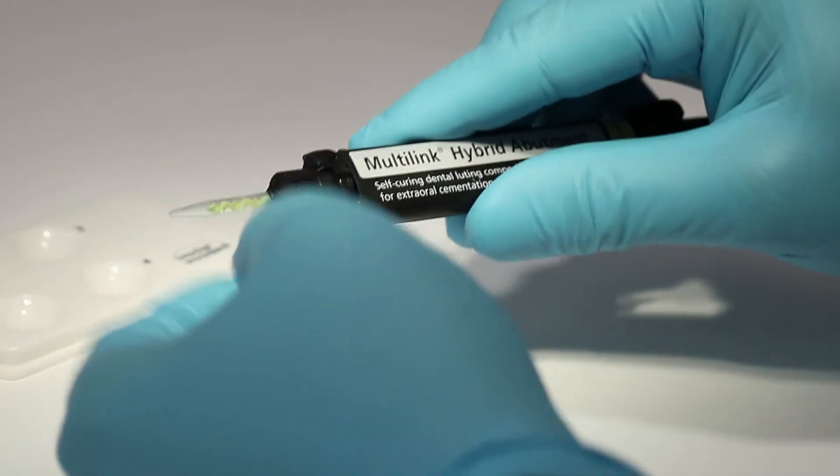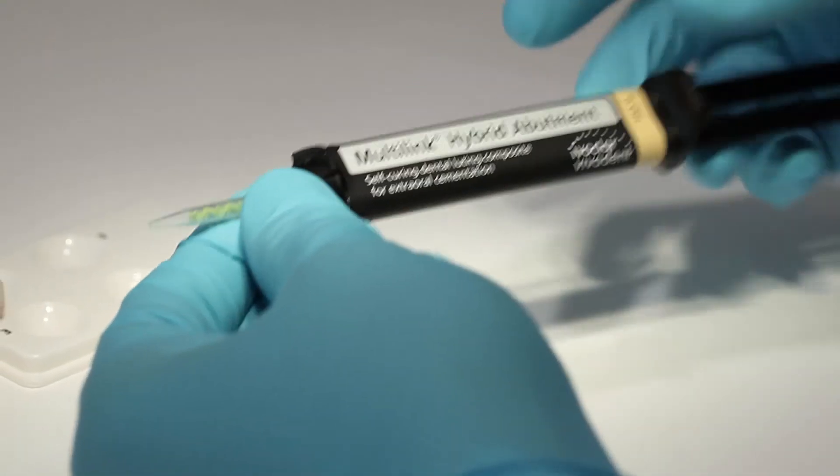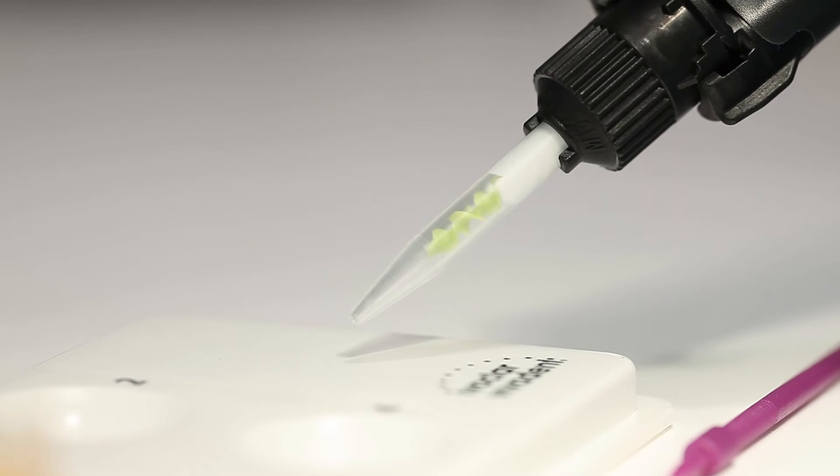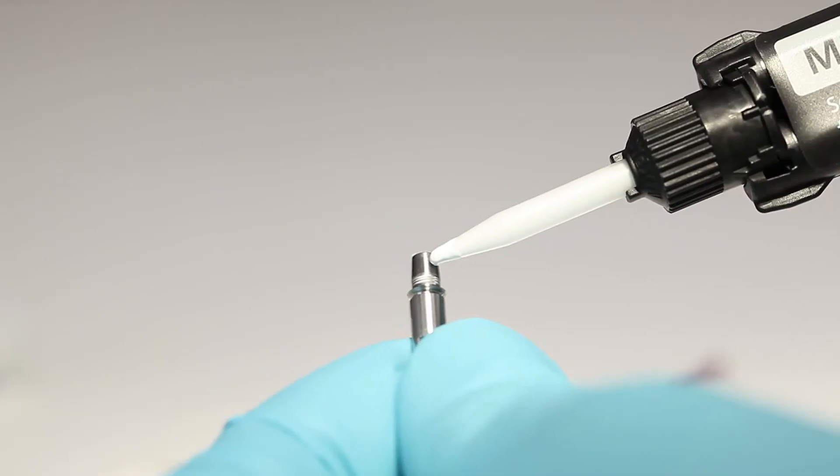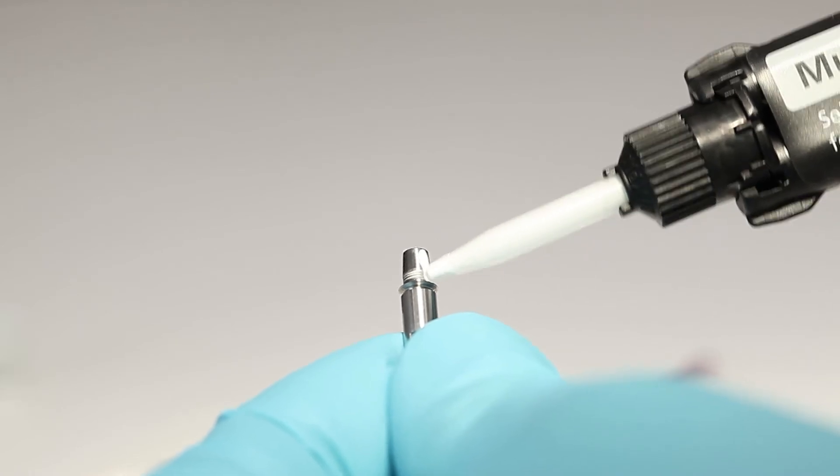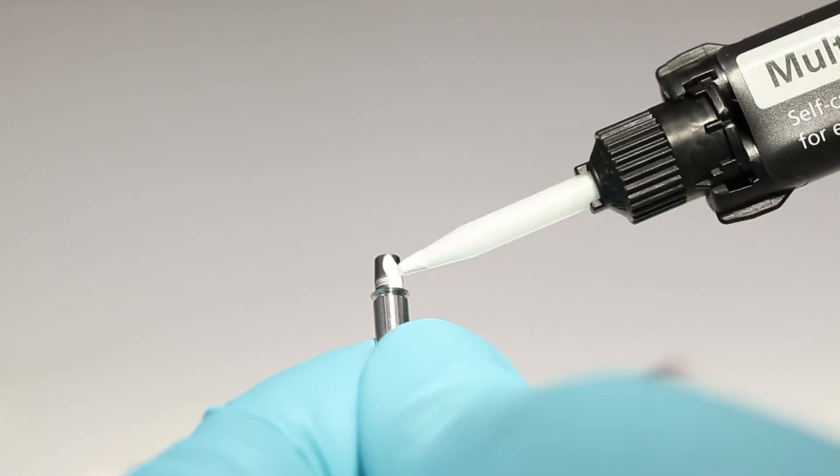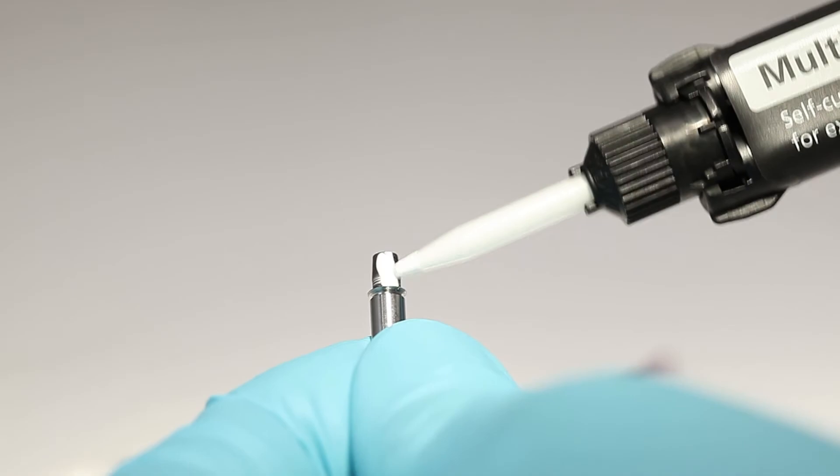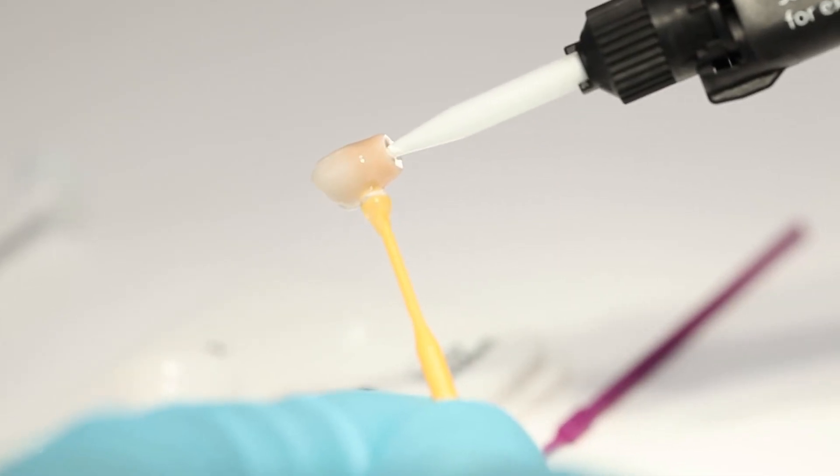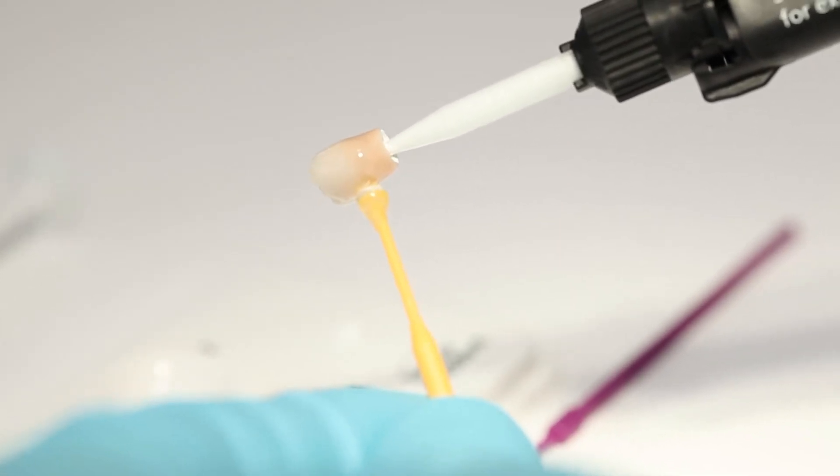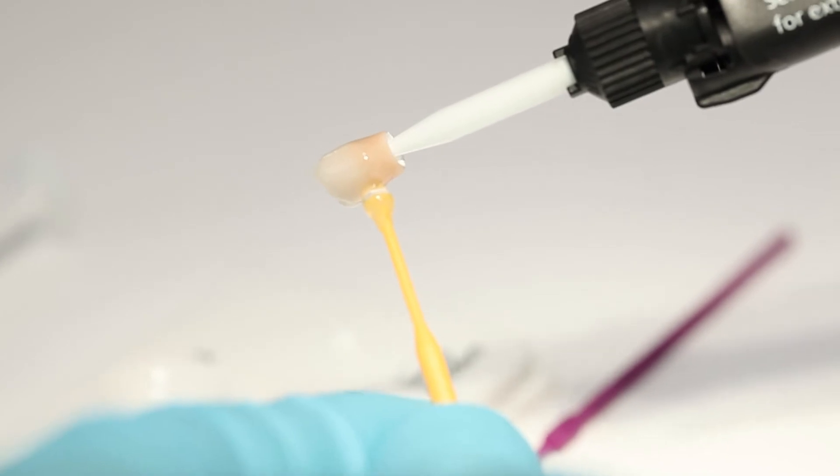Now cement the IPS-EMACS CAD ceramic structure to the tie base using the self-curing multi-link hybrid abutment luting composite. Apply a thin coating of multi-link hybrid abutment directly onto the bonding surface of tie base, then apply a thin coating to the bonding surface of the ceramic structure.